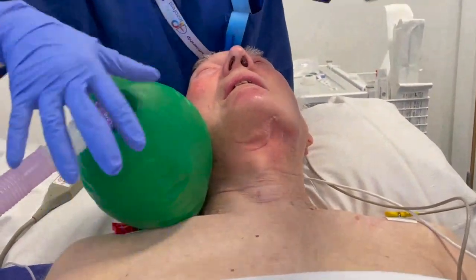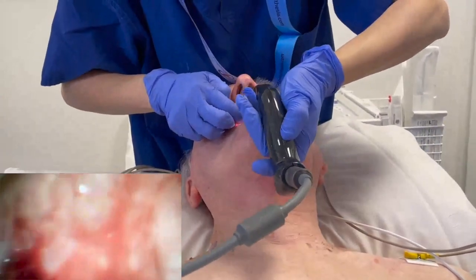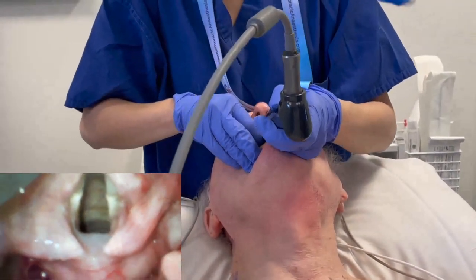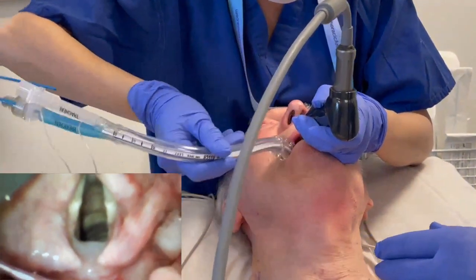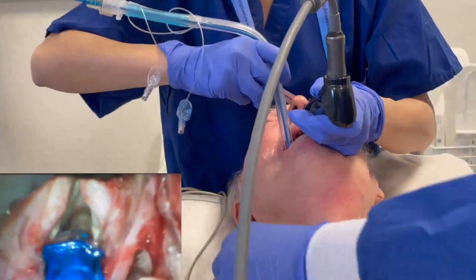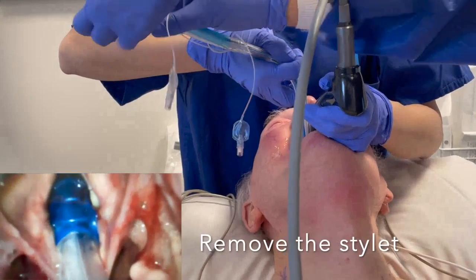To insert a double lumen tube, first bend the tube with a stylet in place and check the cuffs. Get a good laryngoscope view using a direct or video laryngoscope. Insert the tube to reach the glottis, then remove the stylet to unbend the tip.